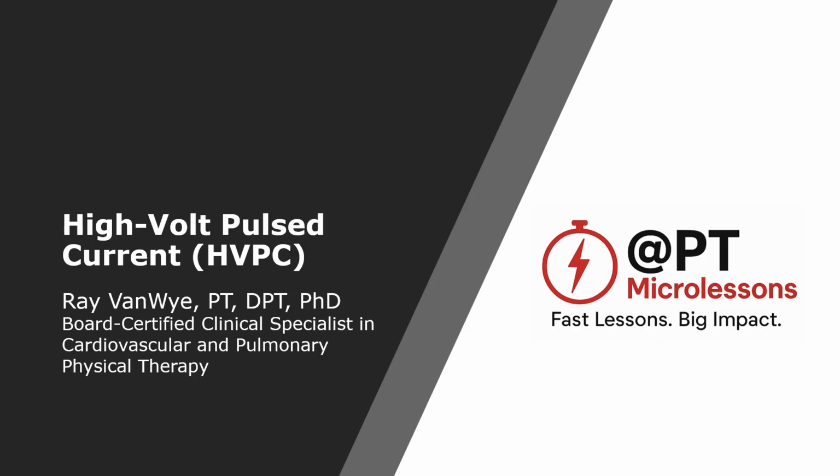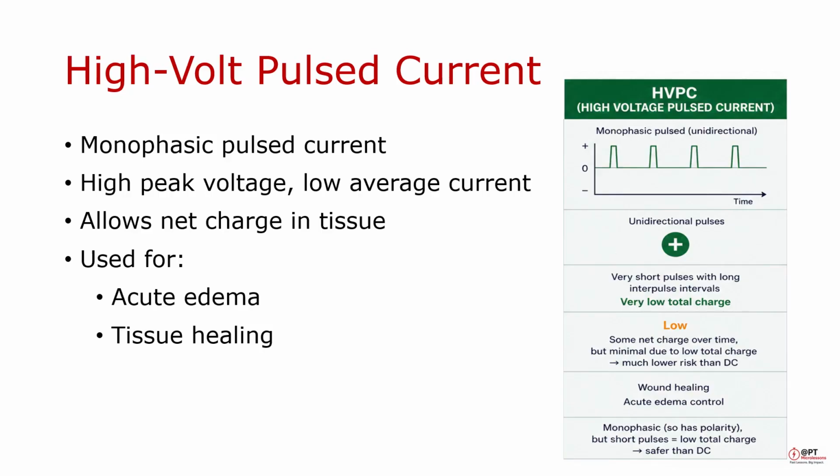In this lesson, we'll focus on high volt pulsed current. We'll break down what it is, how it works, and how it's used clinically in physical therapy. So, what is high volt pulsed current?